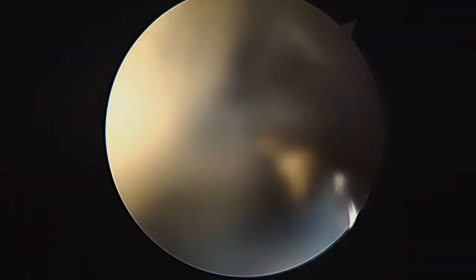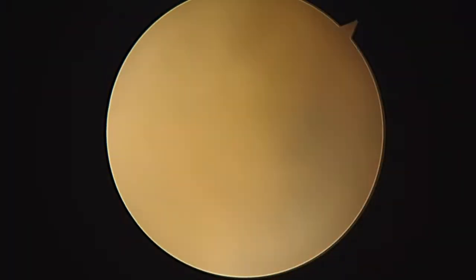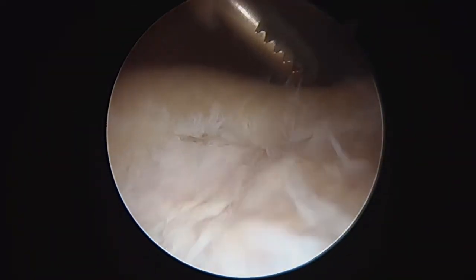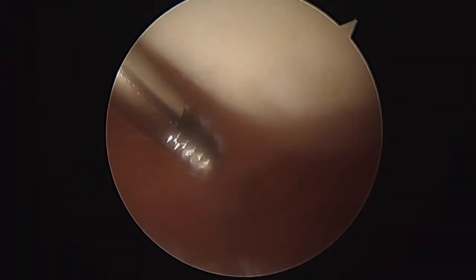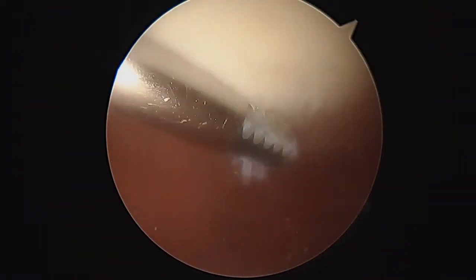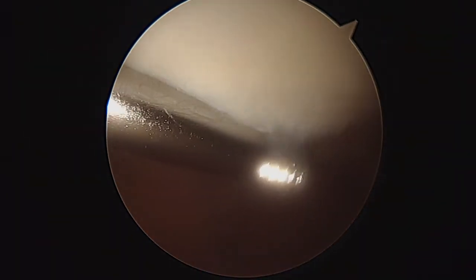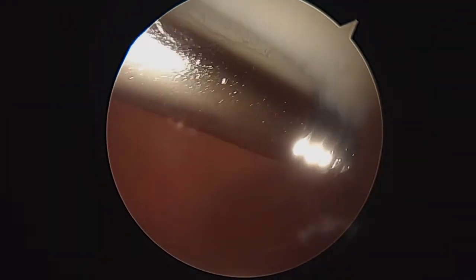So we're going to go ahead and smooth it out as best we can. This is one of the areas where we think our injection will help — not so much to regrow, but to minimize any inflammation from this area. The patella actually looks pretty good up above — a little bit soft, but I don't see a real distinctive tear in the cartilage there.